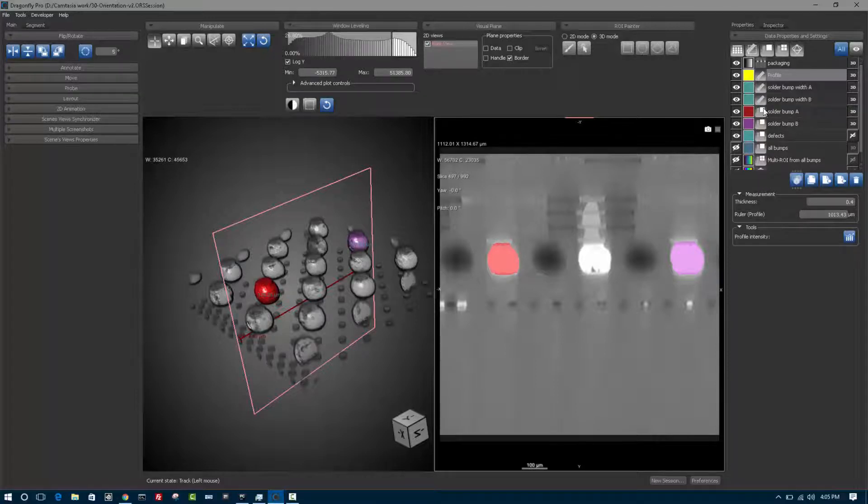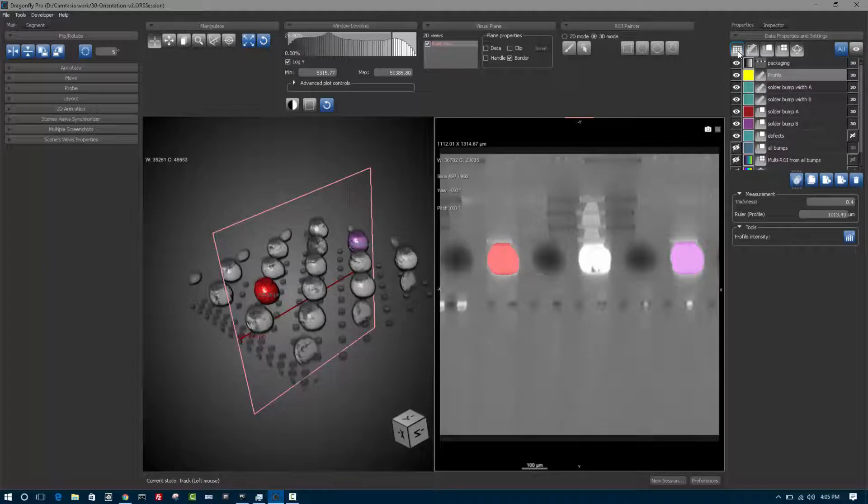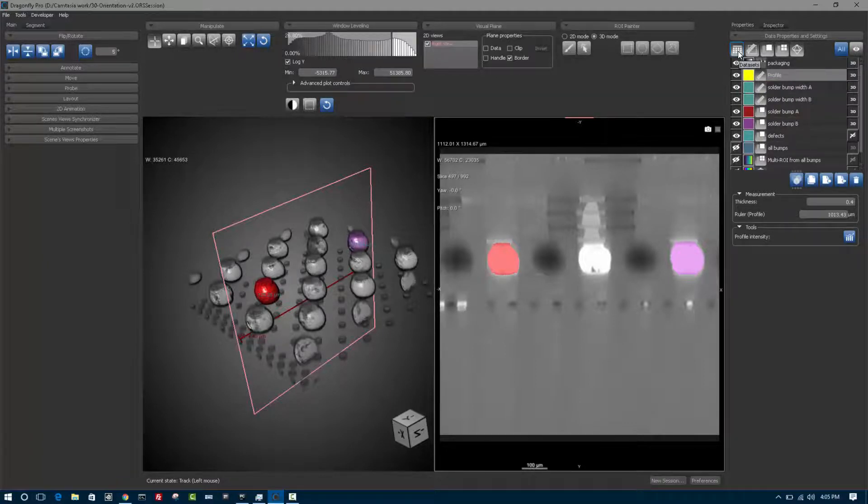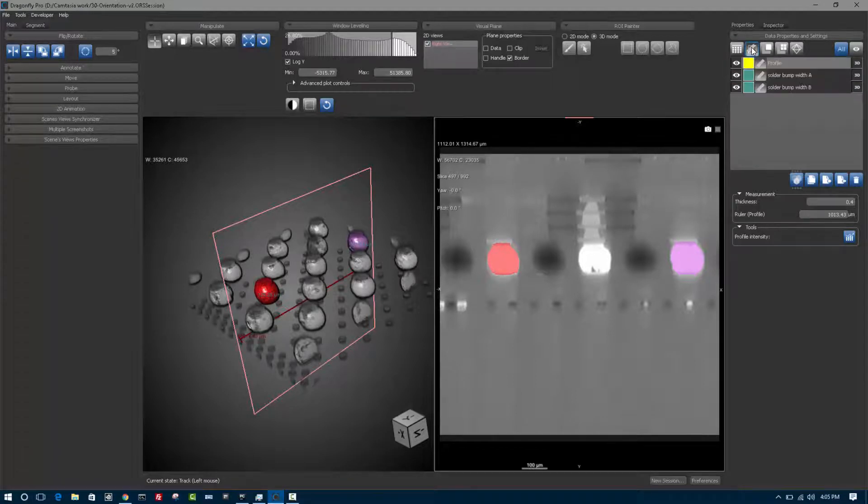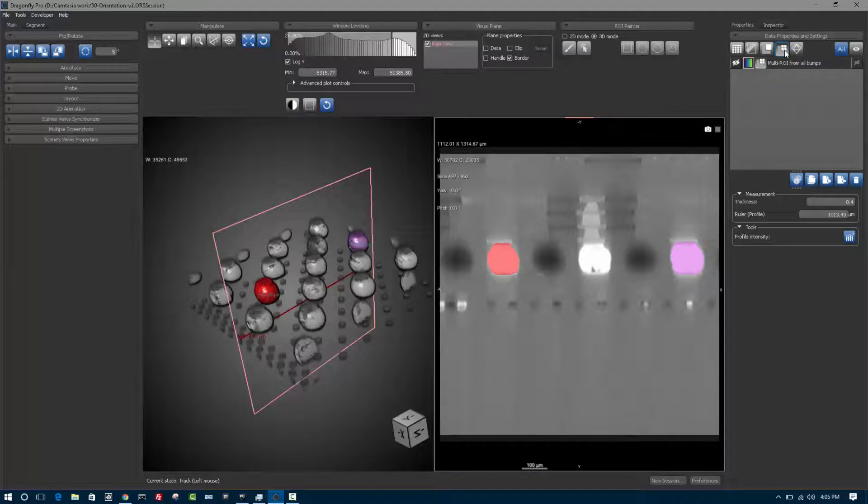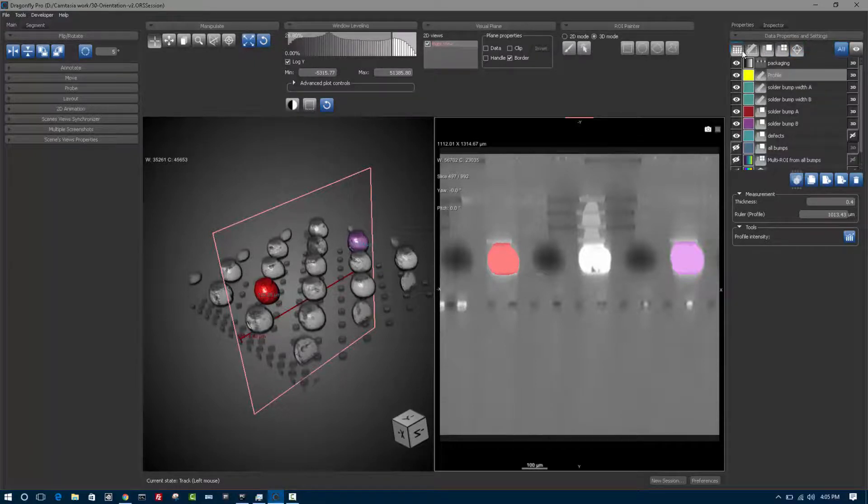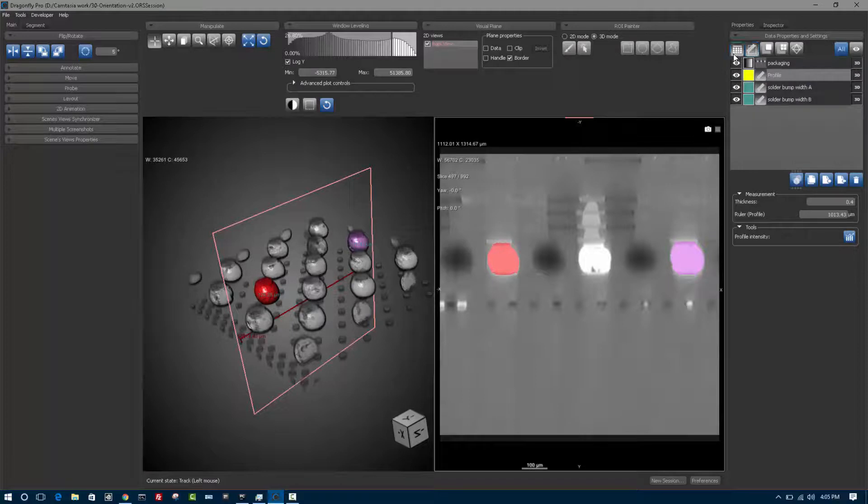Your scene element list can become long and so you have filters at the top. If you want to see only the scene elements that are image data sets, you can click this button. If you want to see only annotations, this button, only regions of interest or multi regions of interest or meshes, etc. You can always see all or you could do control click to see for example images and annotations.